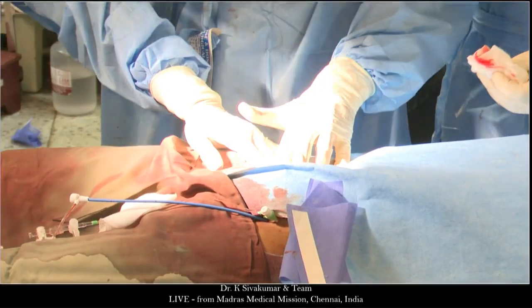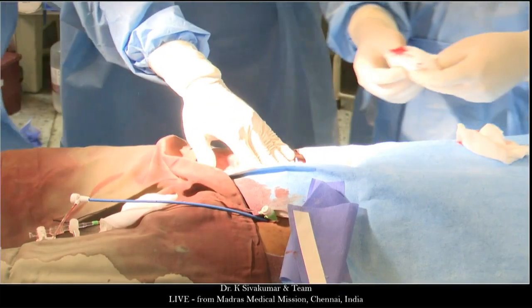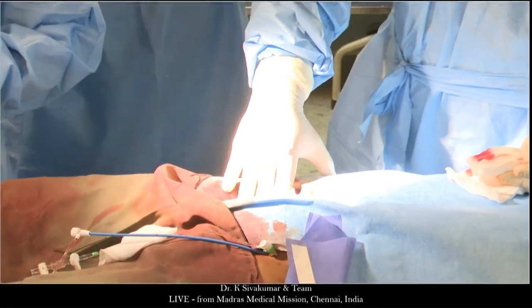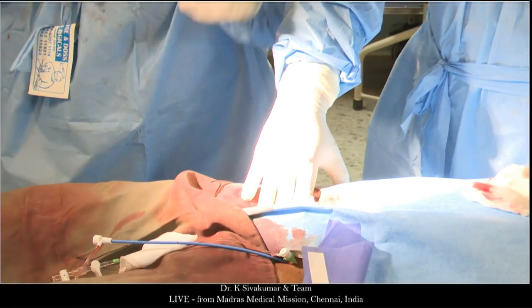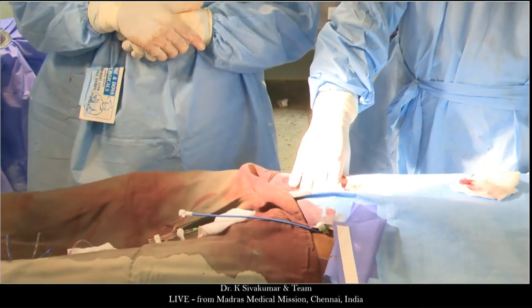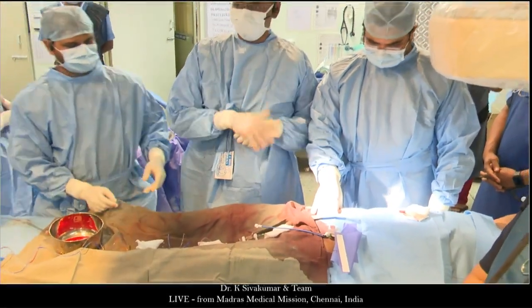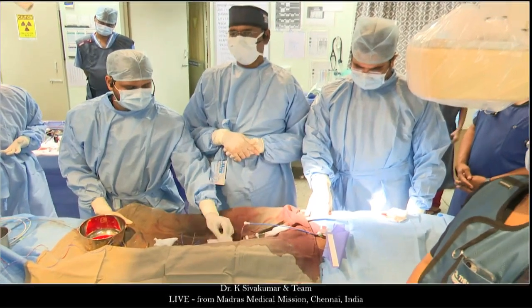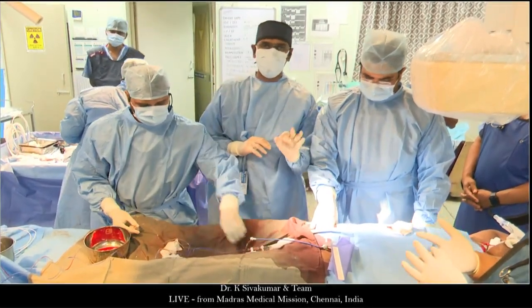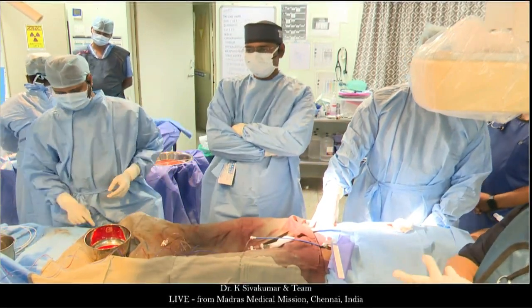So the answer to the question is, if you have a guide wire circuit still present, you will be able to push the lower end of the embolized stent in the right atrium up with a compliant balloon, something like either a Cook Coda balloon or a Medtronic Reliant balloon. There are ways of tackling an embolized stent if it is within the wire by using an overlapping covered stent. Great. Thank you, Sivakumar.